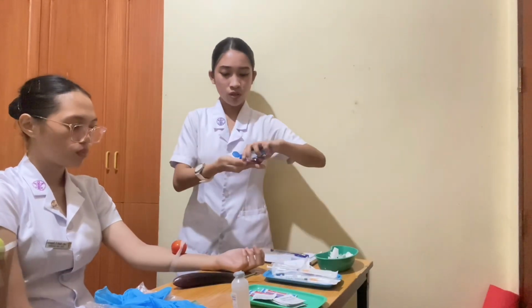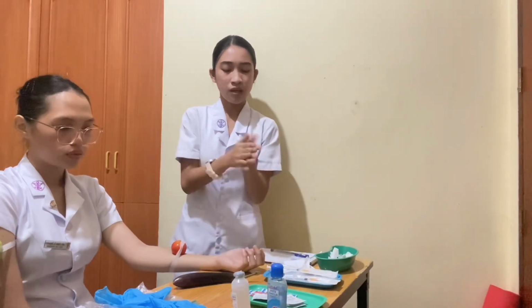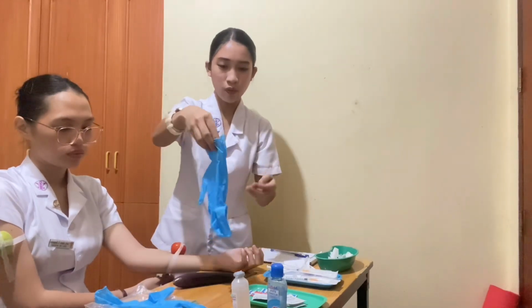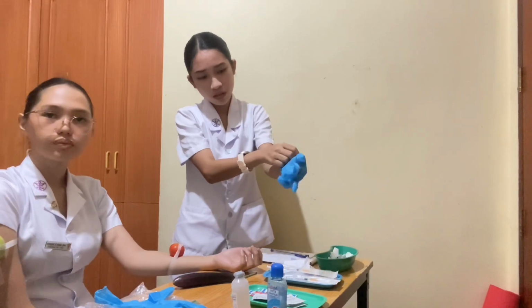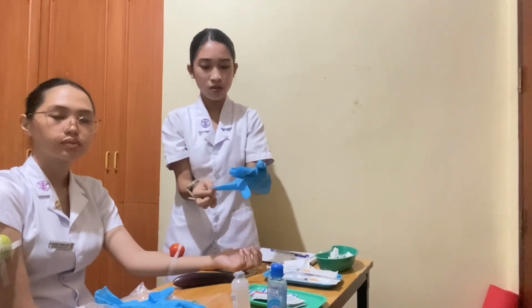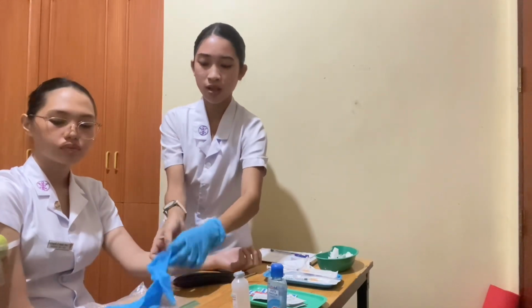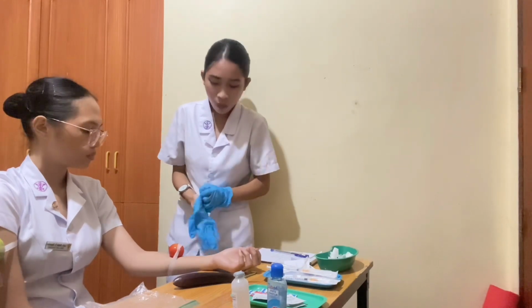But first, we're going to do hand hygiene. So I'm just going to wear my clean gloves. Okay. Okay, ma'am, for a while, I'm just going to wear the gloves.